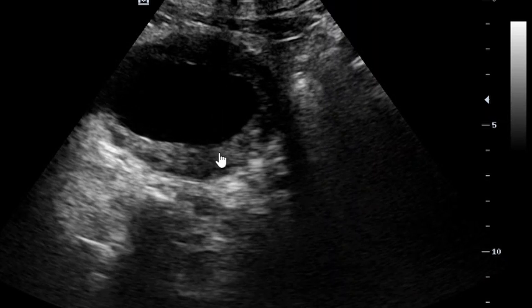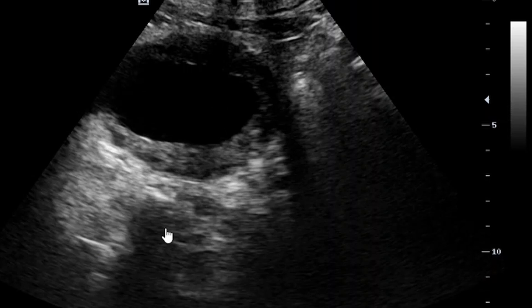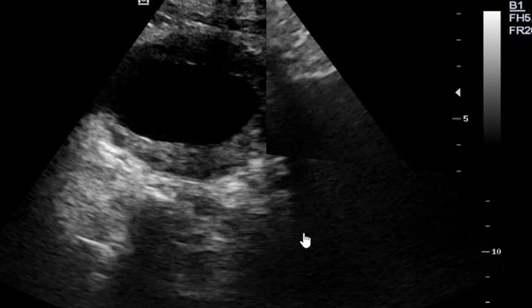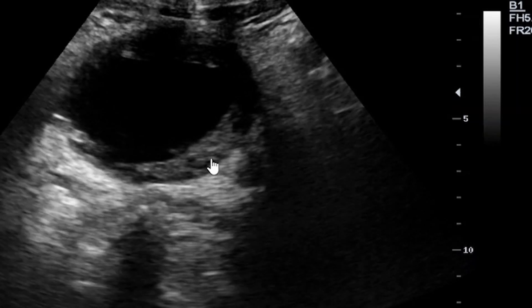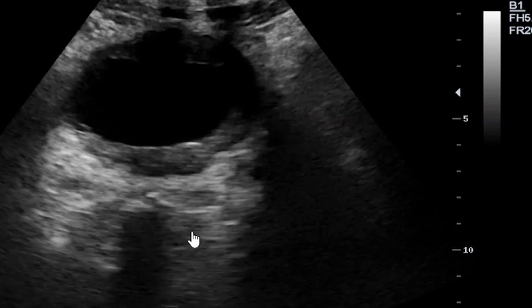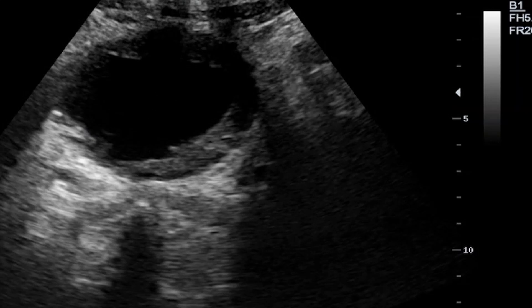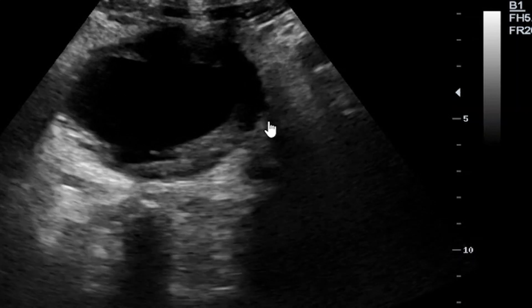When the urine is not clear — with internal echoes — or when there is urinary stasis, meaning urine stays for a long time due to blockage or infection, you can actually see the formation of sludge. Calculi can also develop. In this image, the bladder walls are again very much thickened, though we do not see urinary bladder calculi per se here.